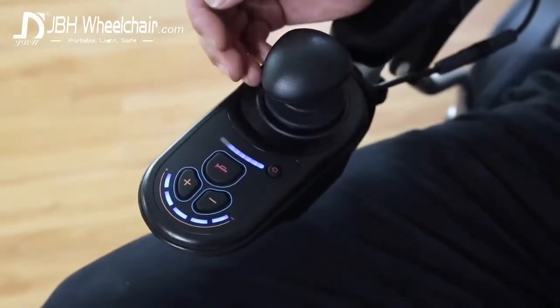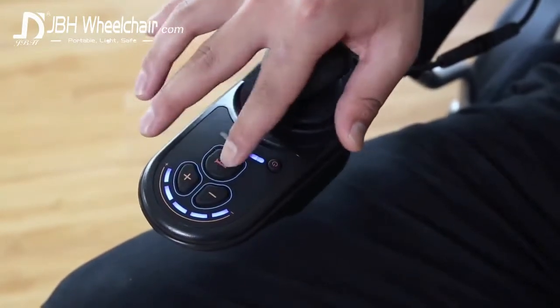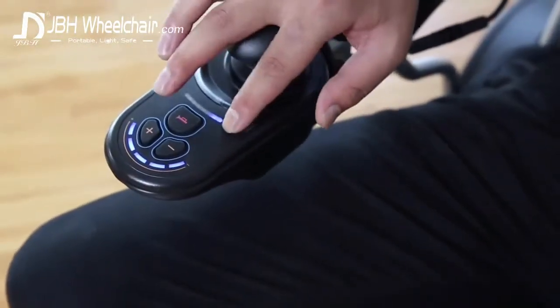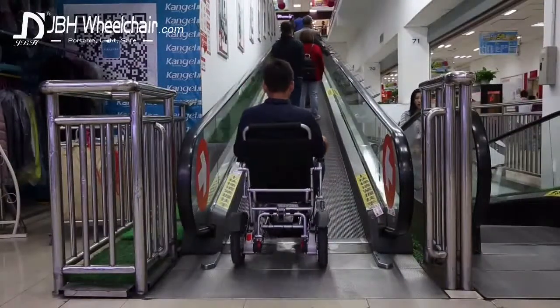The 360 degree joystick is simple to use, giving you total control over your preferred maximum speed. Thanks to the two batteries, the JBH-D09 can travel with a weight of just under 400 pounds — that's right, 400 pounds — at the speed of nearly 4 miles per hour, and yet can fold into the size of a regular suitcase.